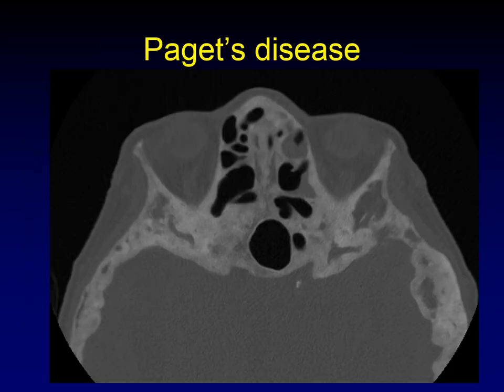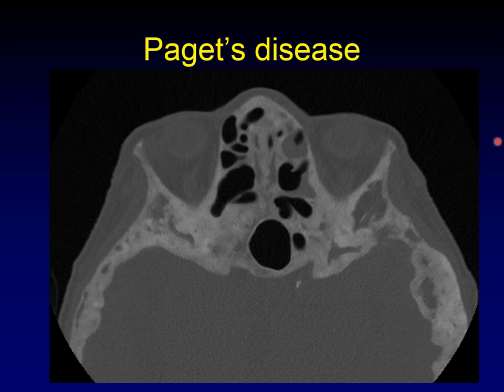If there's a pagetoid form of fibrous dysplasia, of course Paget's disease is a mimic. Look at the expansion of bone all through the central skull base — this one happens to be Paget's disease, but it looks a lot like the pagetoid form of fibrous dysplasia.